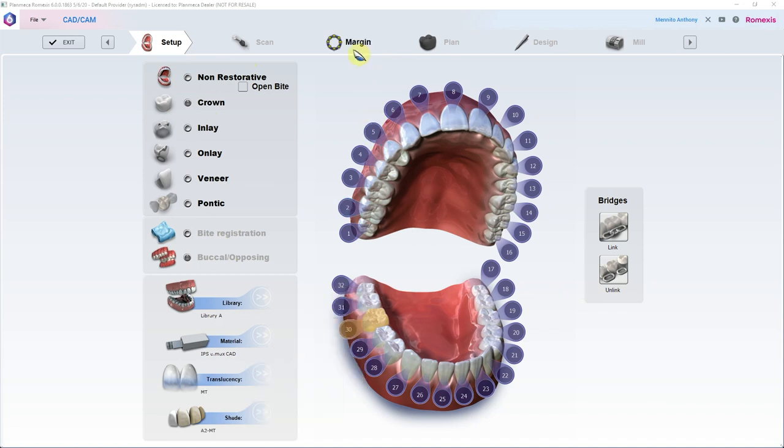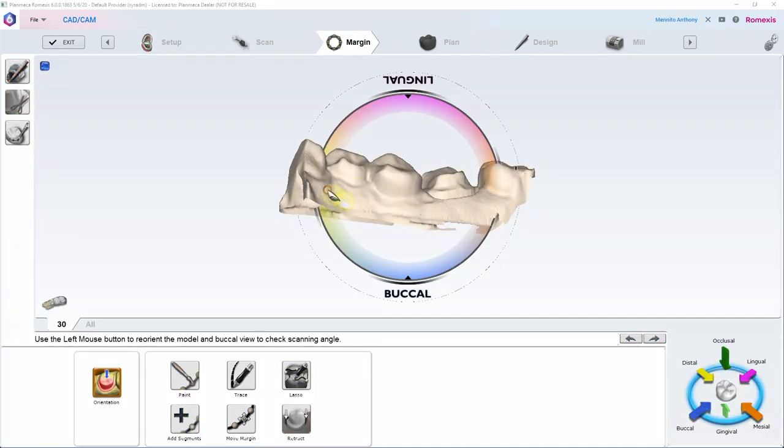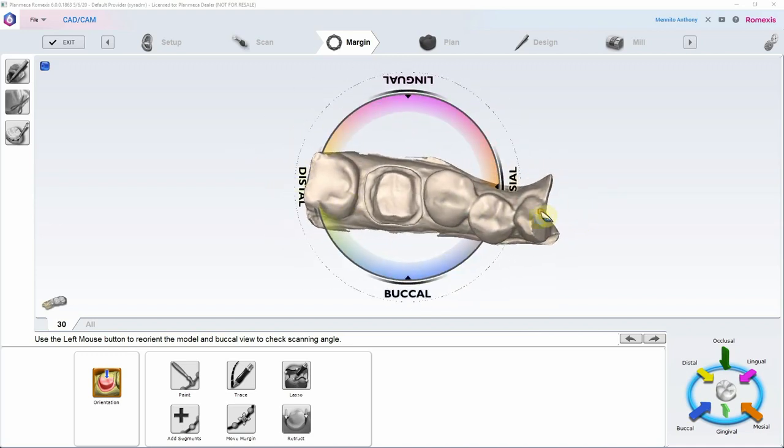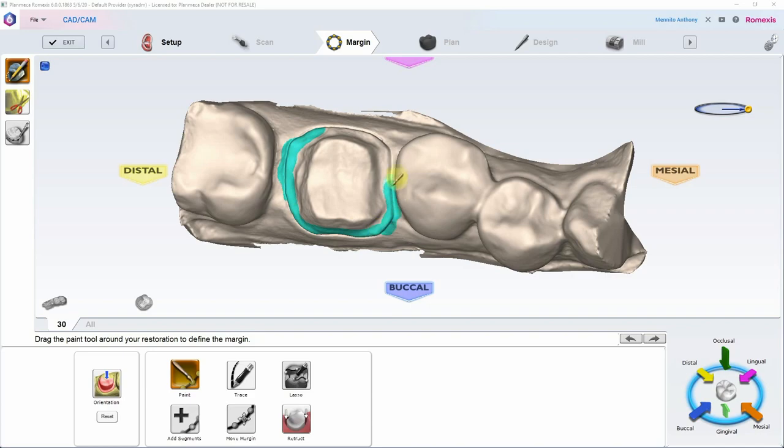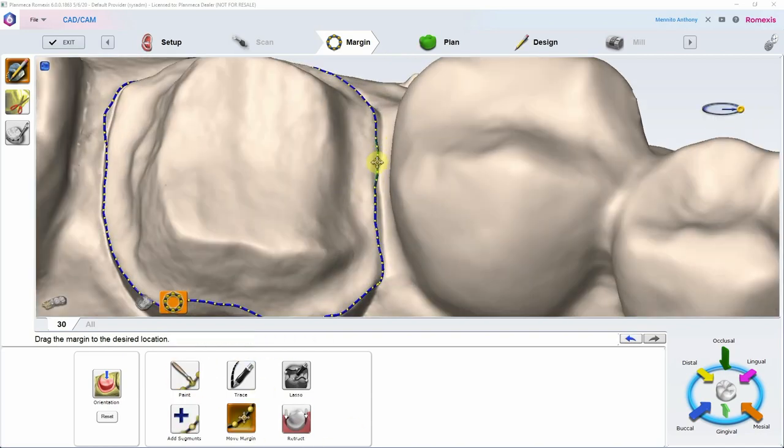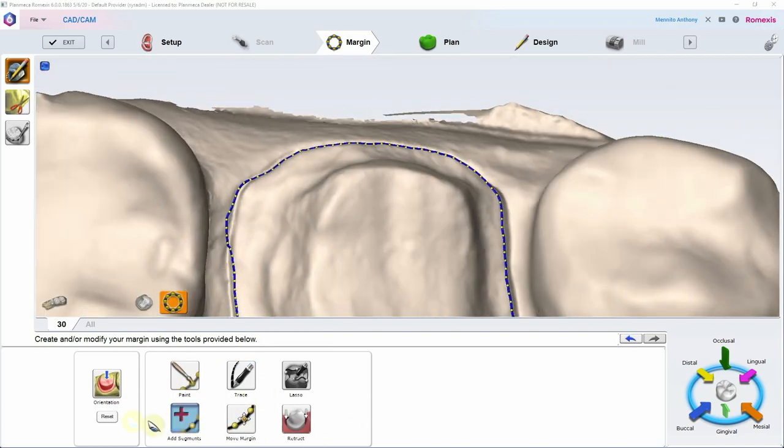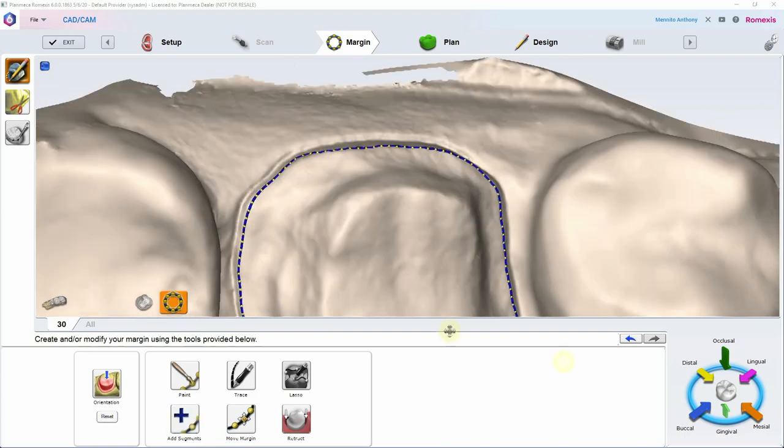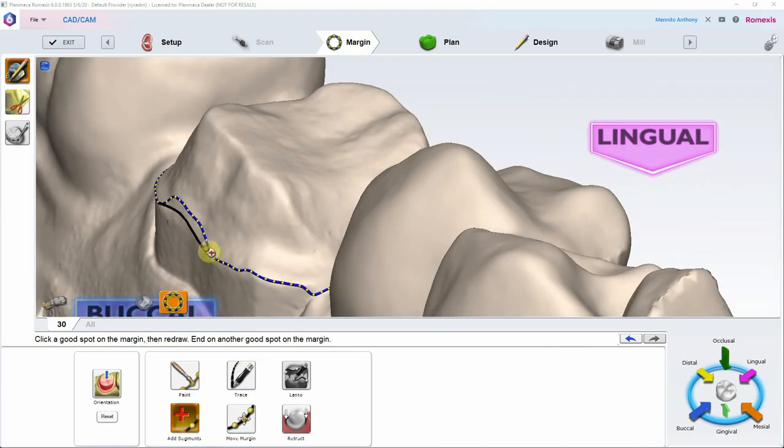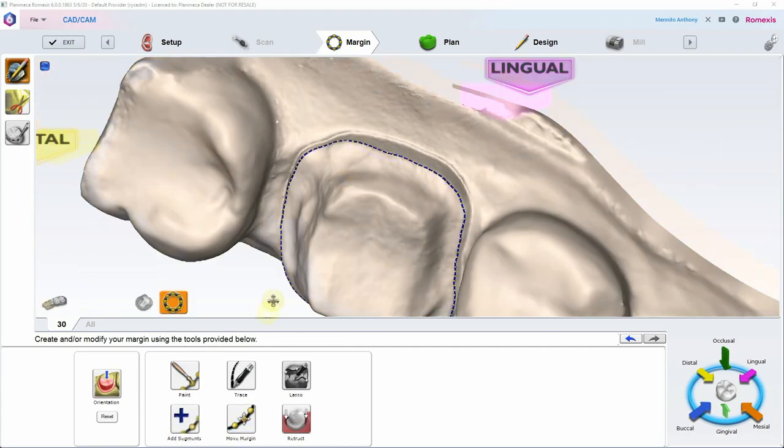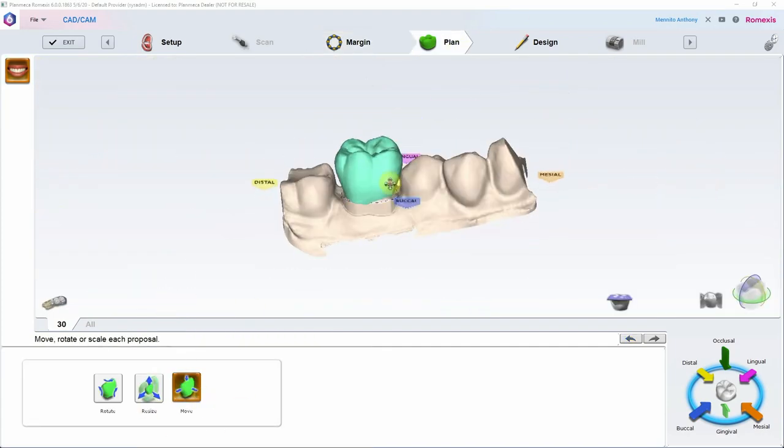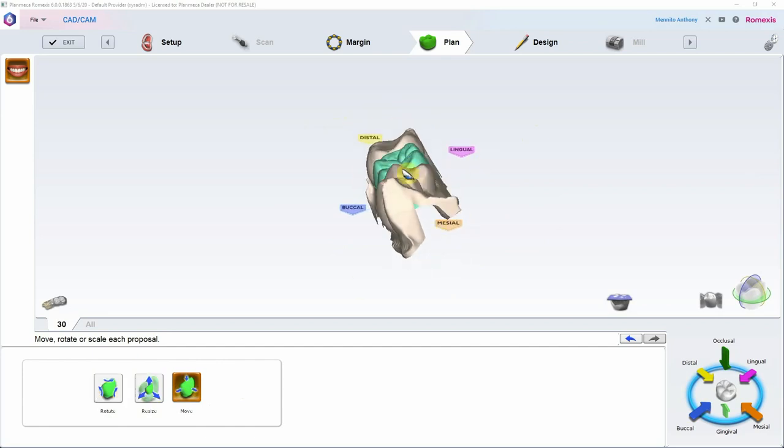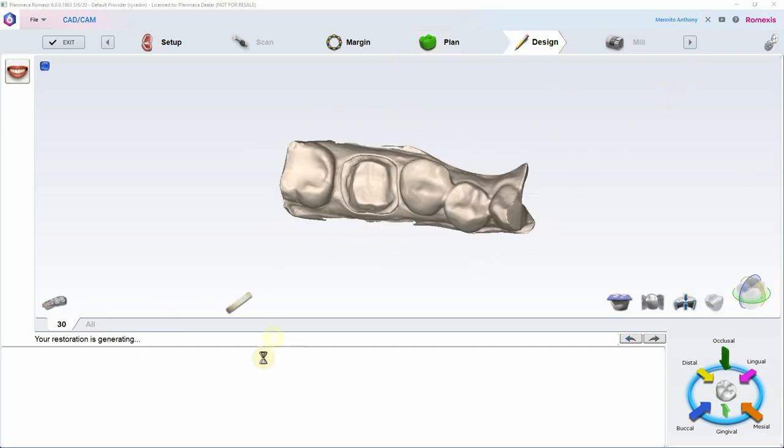I will say that there are two main downfalls to this workflow. One is that the STLs that are imported are basically black and white. STL is a black and white file. There is no color associated. So you do lose the color that you would have gotten in your original iTero scan.